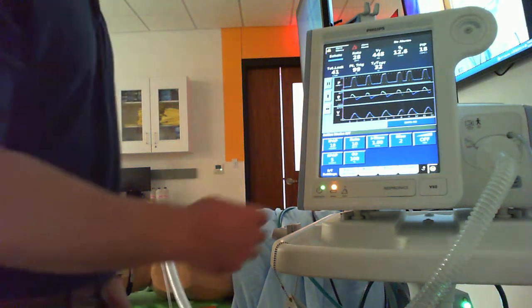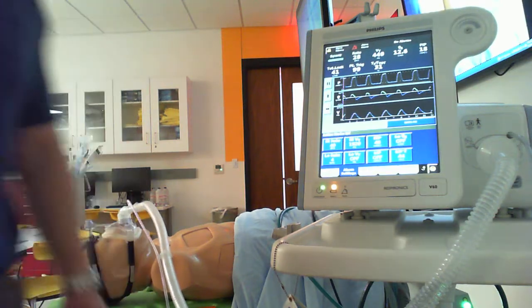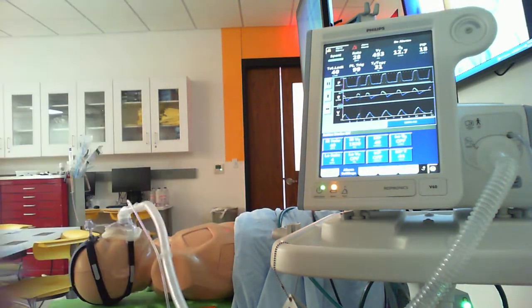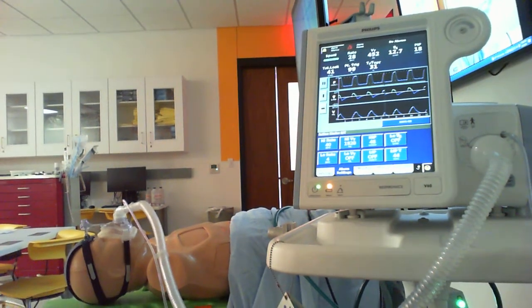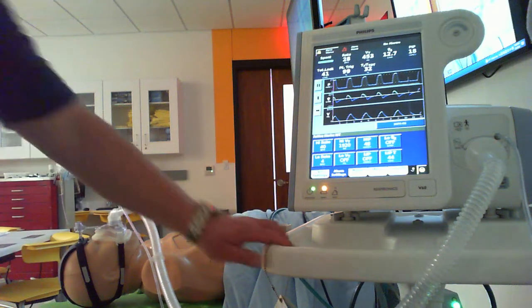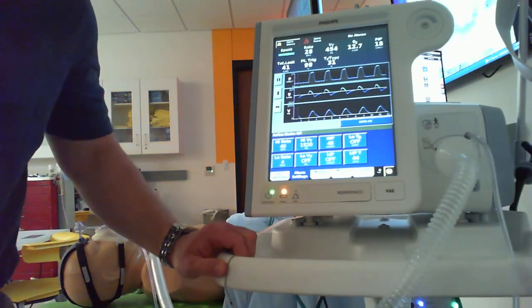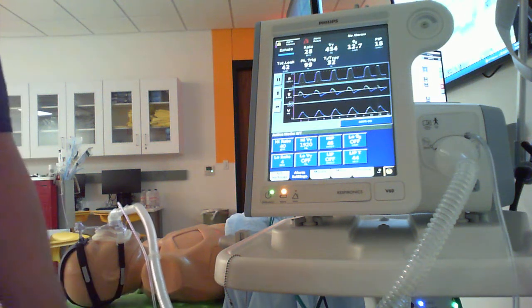Let's talk about alarm settings here, okay? So alarm settings, alarms are very important, and it's going to be difficult to kind of see some of these alarms that I have set right here, okay? Because the screen's so blurry, so let me see if I can kind of move that a little bit closer. I don't know if that's better or worse, maybe a little bit better there, okay? So we have the ability to set alarms. Alarms should help us, and not be a burden, okay? So you don't want them alarming all the time because nobody's going to pay attention.